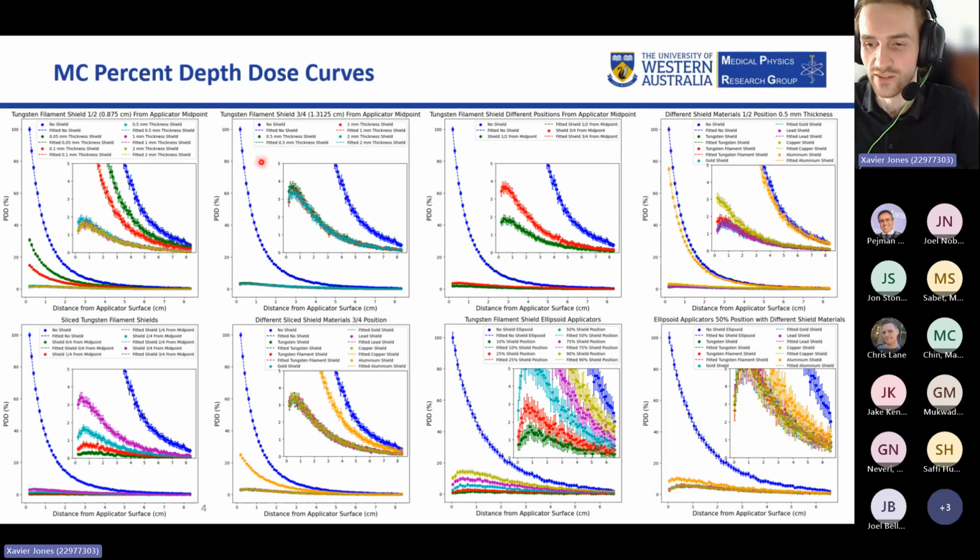The first plot shows the effect of changing embedded shield thickness, whilst the second plot shows the same, different shield position. These indicate similar conclusions about the thickness derived earlier. The third plot shows the effect of embedded shield positions at the same thicknesses.